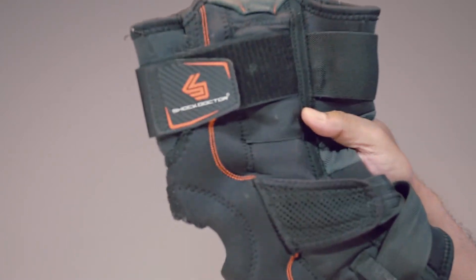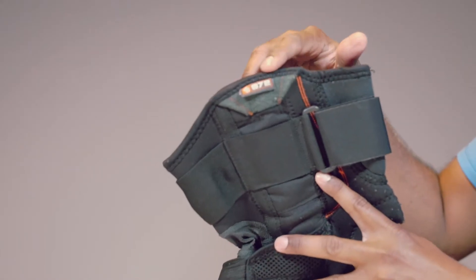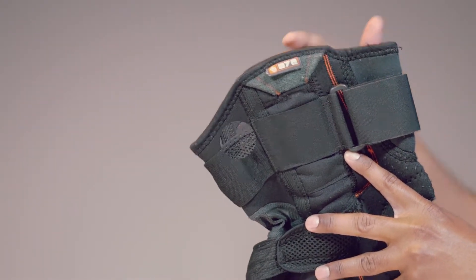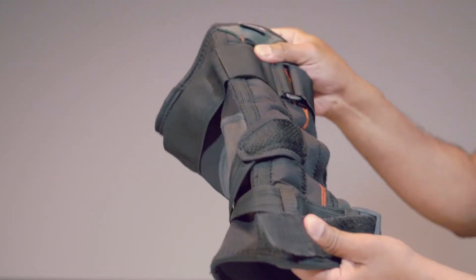This is a knee brace from Shock Doctor. The one I have here is model 872. There are a few similar models, but this one comes with dual hinges.